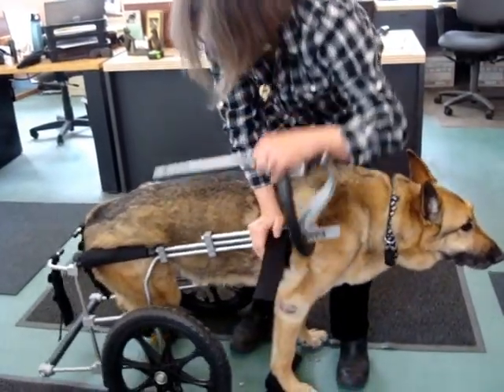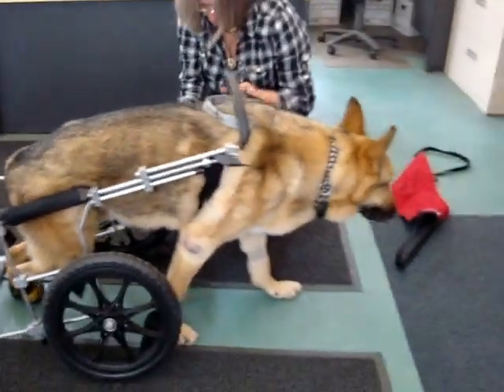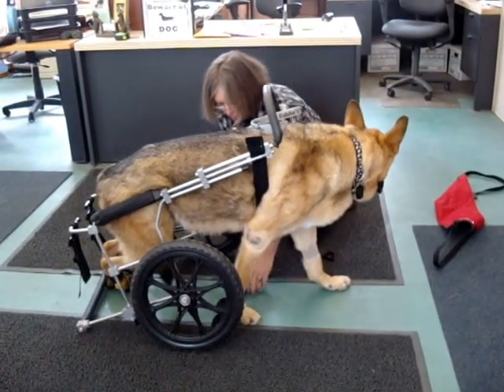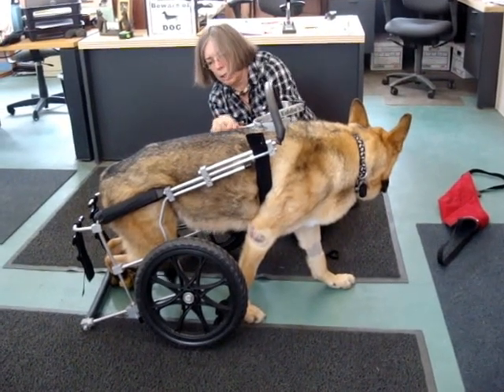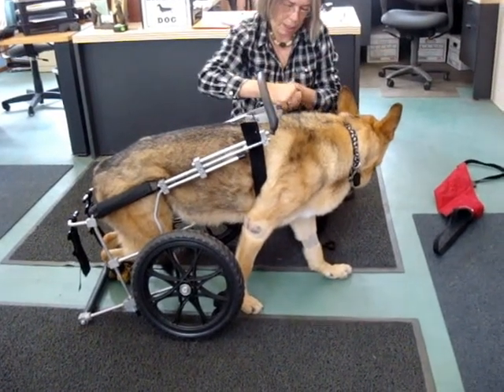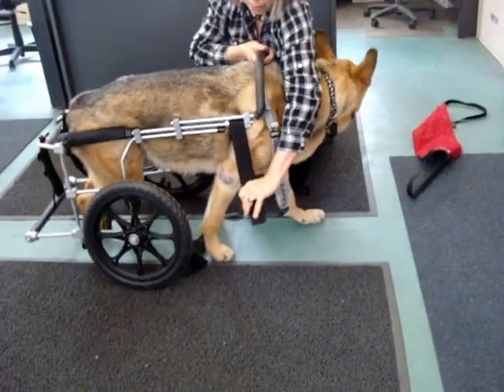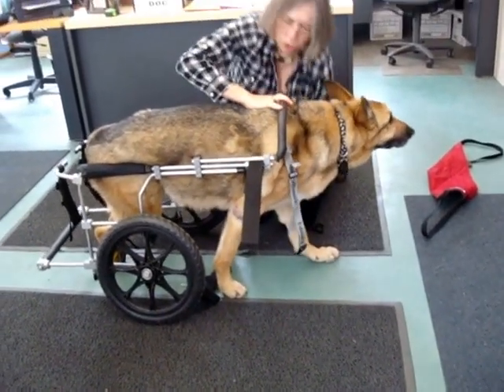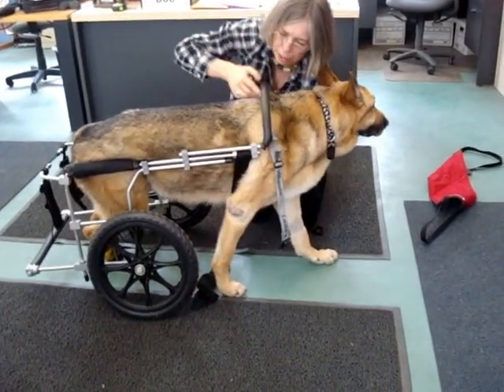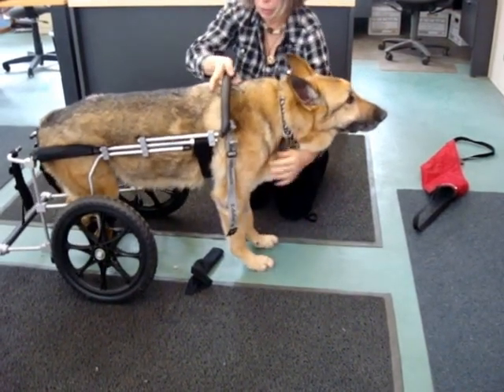So there you go. So now you can see how the yoke wants to fly up off his shoulders, and that's fine — it tips backwards. So now, pulling on the support strap, placing my hand on his shoulder blades.